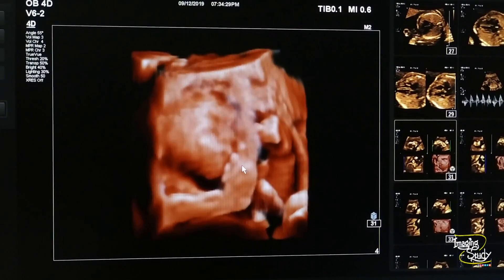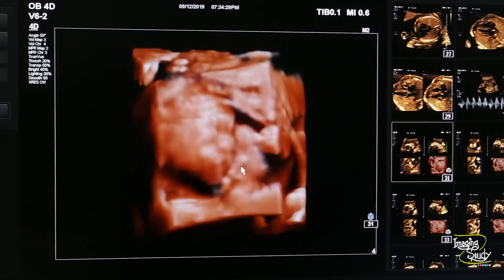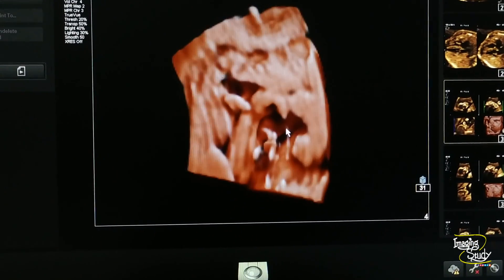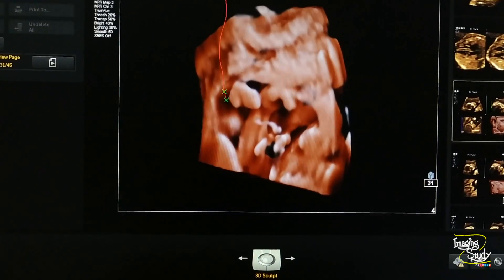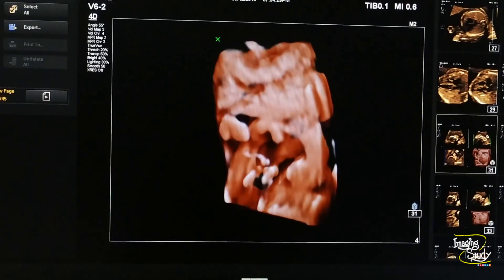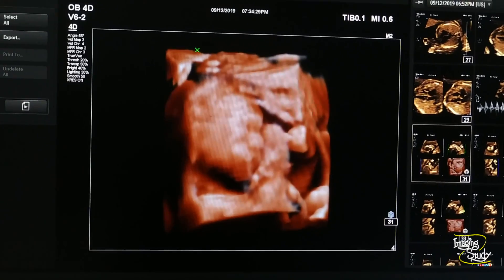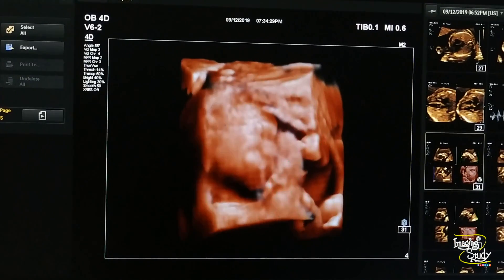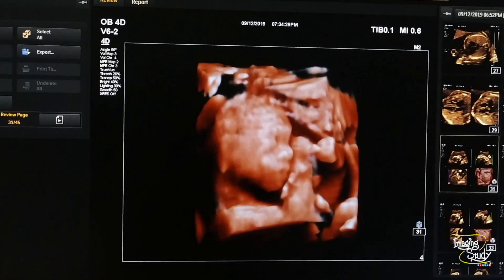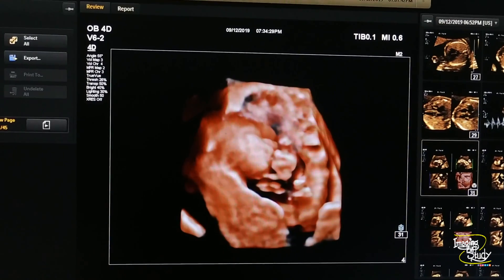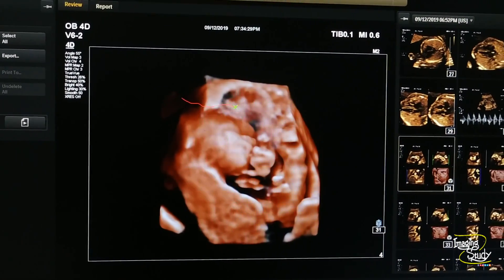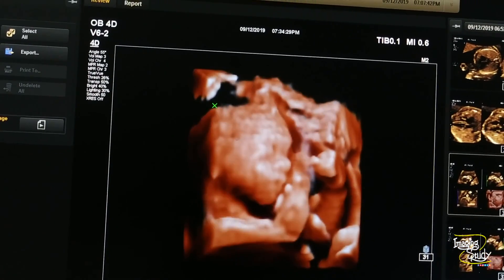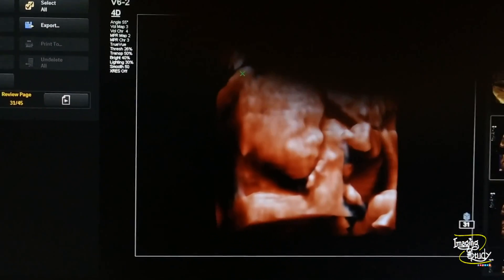You can see many things need to be cut. Now let's start with the scalp option — on my machine it's called the magic cut option. I'm rotating again and changing the threshold to adjust the density of the image, then cutting this part as well. You can see now the face looks quite good. Here's a tip: when doing 3D ultrasound you should never get satisfied with your image — give it time and you will get better pictures.